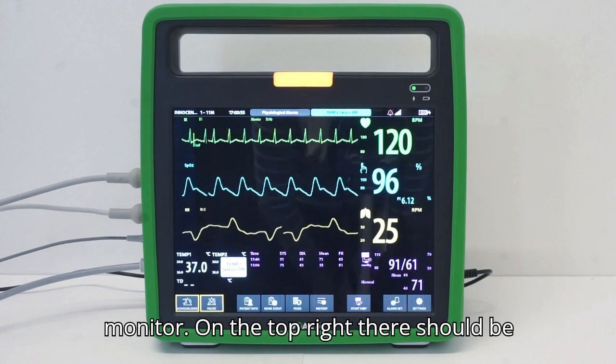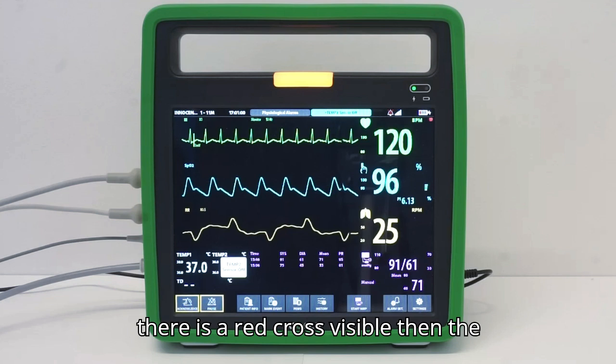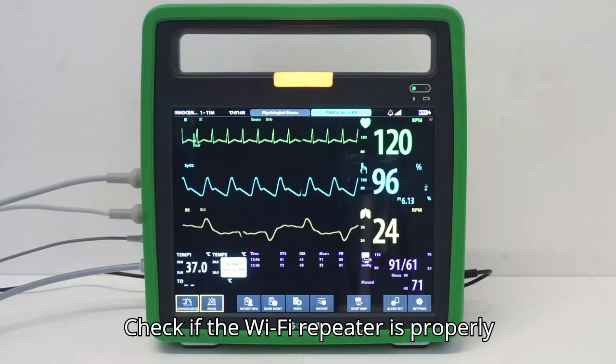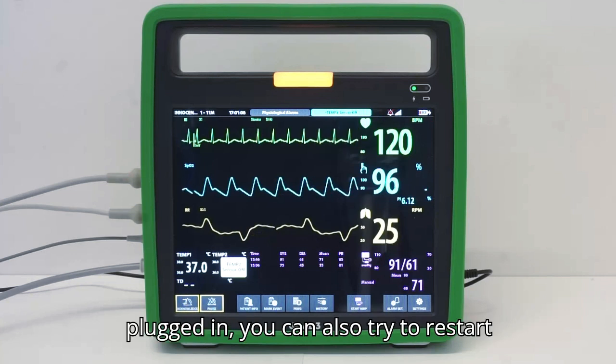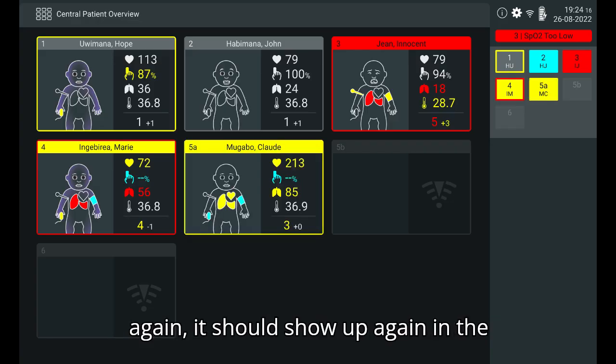On the top right, there should be an icon indicating connection. When there is a red cross visible, then the monitor is not connected to the Wi-Fi. Check if the Wi-Fi repeater is properly plugged in. You can also try to restart the monitor. When there is connection again, it should show up again in the app.